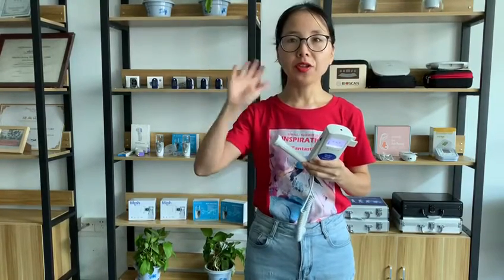Hi Julie, this is Emma from Wufeng Campania. I want to introduce our fetal doppler for you.